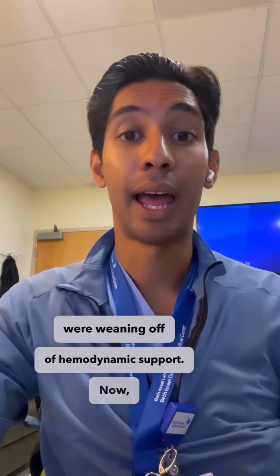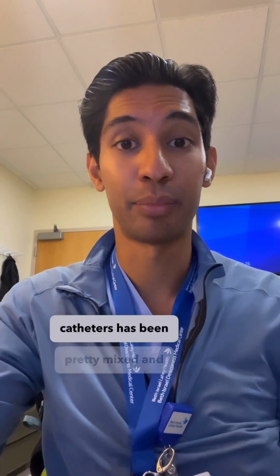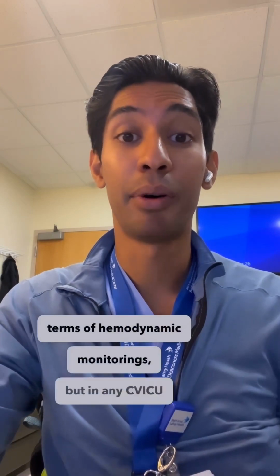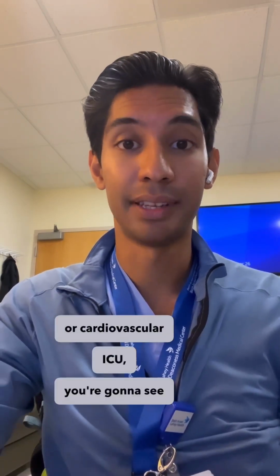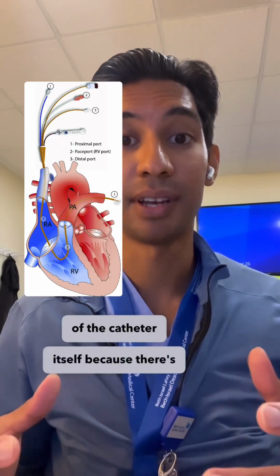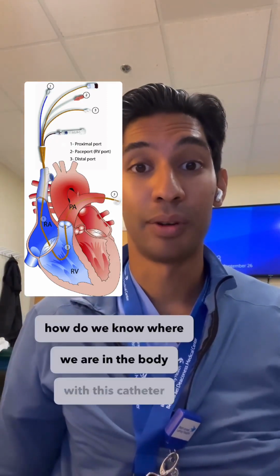hemodynamic support. Now, data around pulmonary arterial catheters or Swan-Ganz catheters has been pretty mixed, and it hasn't really been shown to increase benefit for patients in terms of hemodynamic monitoring. But in any CVICU or cardiovascular ICU, you're going to see these catheters, and it's helpful to know the anatomy of where it is in the body, as well as the anatomy of the catheter itself, because there's multiple different ports that we're managing.